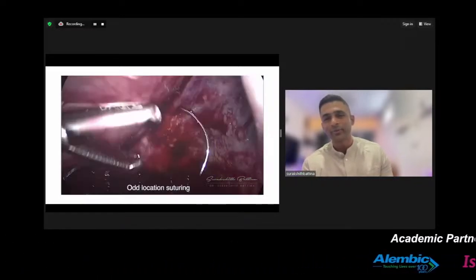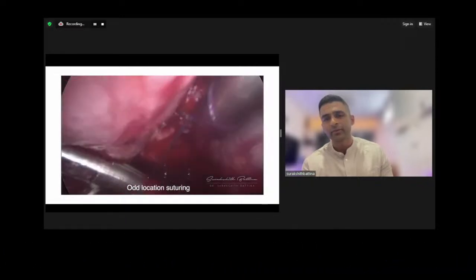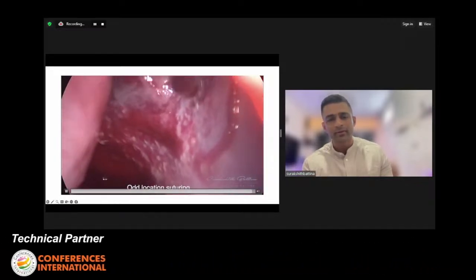So I think it's very important, because if you have these kinds of odd locations of bleeding, you should definitely know how to suture at these odd locations as well, so that it makes your job easier.